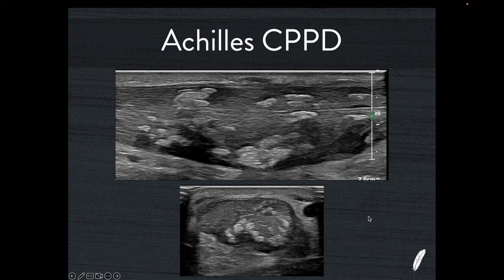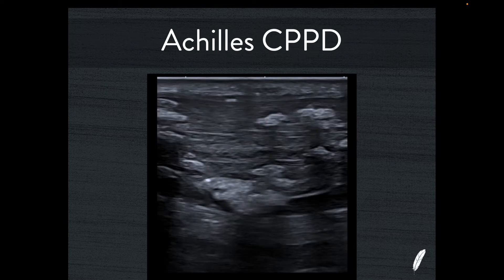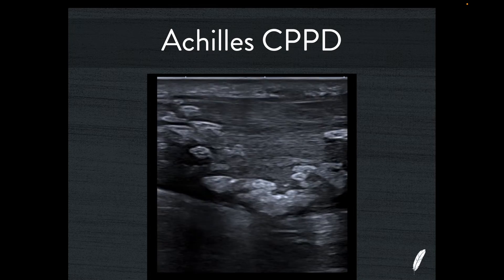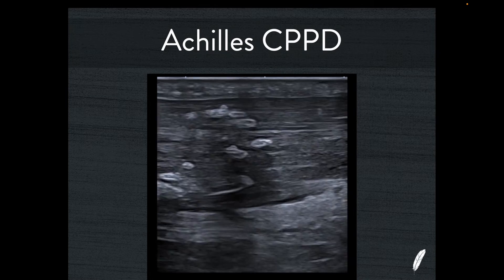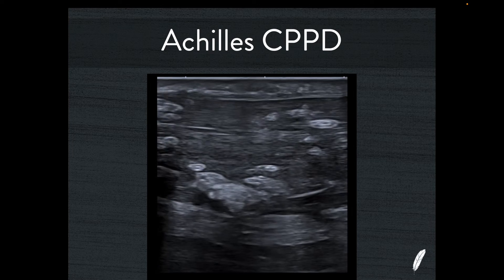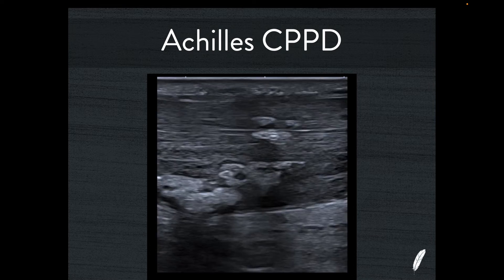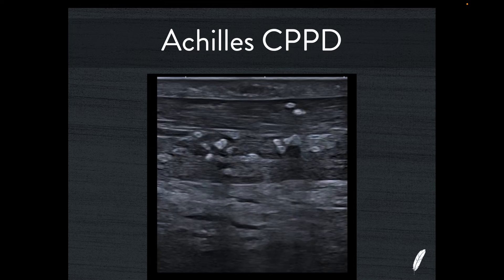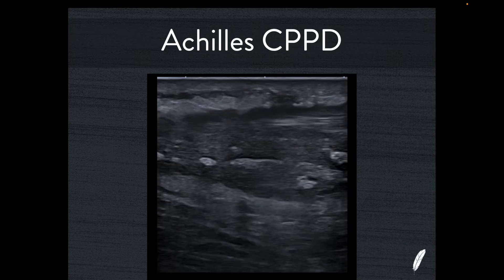So I was puzzled. Taking more videos and images, you can see there are innumerable deposits of crystal deposition inside the Achilles tendon — a very widespread process. If you look at the background texture of the Achilles tendon, it is abnormal. There's no doubt there's an element of disrepair tendinosis overlaid with some type of crystal deposition disorder.